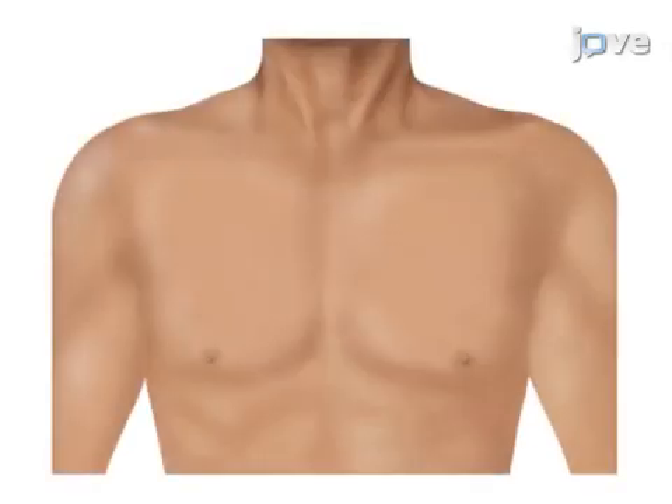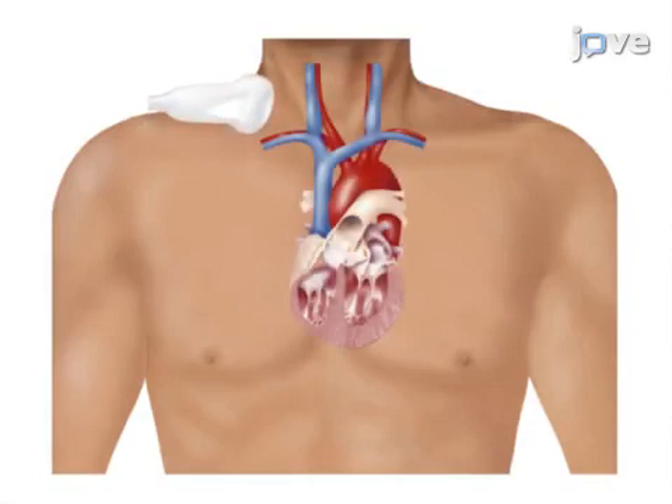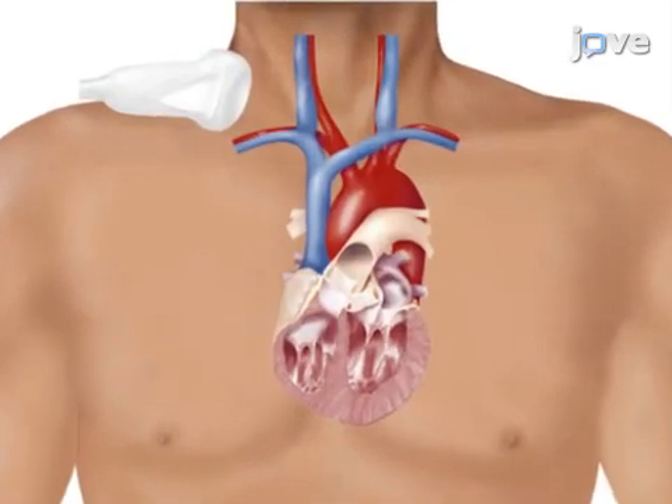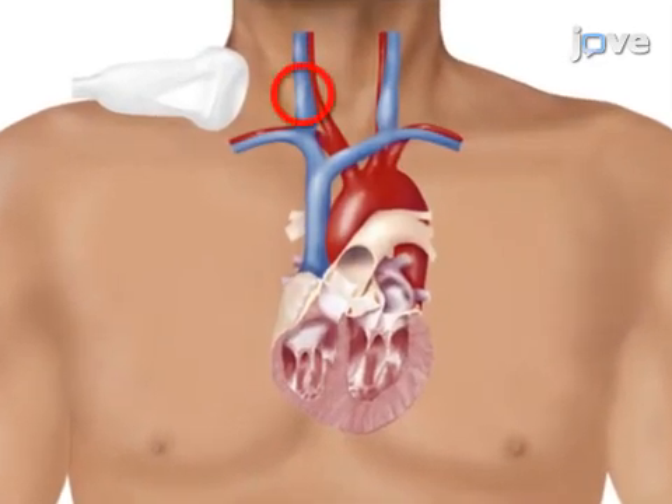This is accomplished by first obtaining a full longitudinal ultrasound view of the superior vena cava, the adjacent ascending aorta, and the right pulmonary artery. The second step is to pre-scan the central venous catheter insertion site, such as the right internal jugular vein.